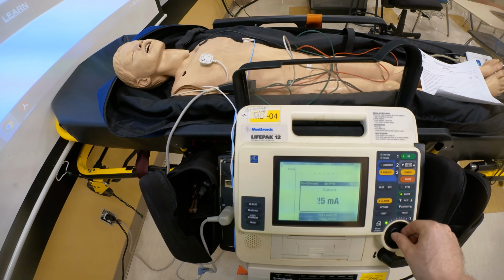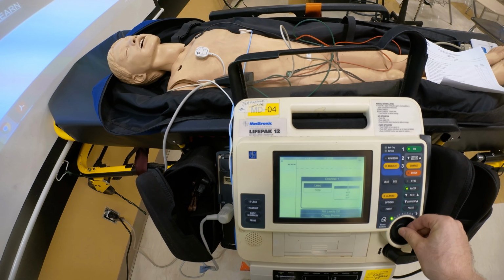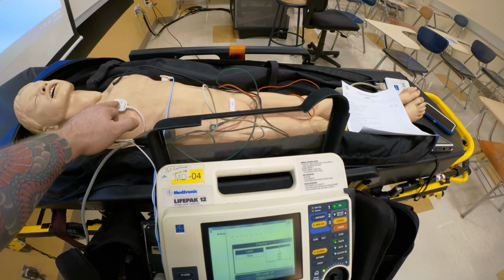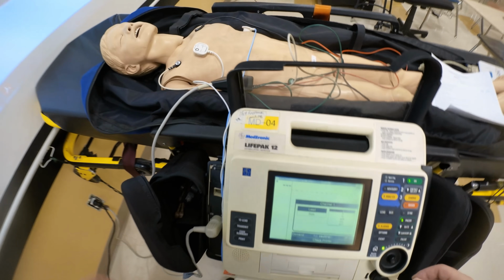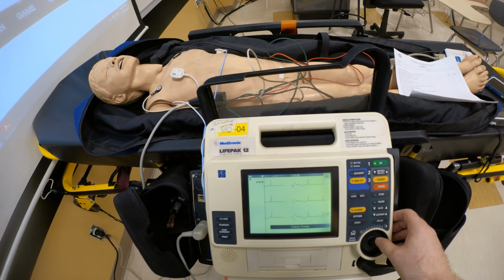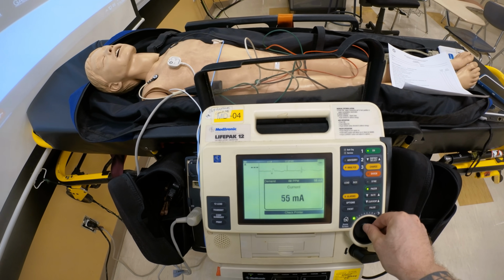And I start selecting my current, I have nothing, right? I have nothing. Even if I go to, right? I cannot select anything because this machine cannot both sense and provide electrical therapy through this alone. So all of this must be connected, right? So once everything is connected, then my pacer is definitely 60, right? Definitely is going to work, right? So you'll see it's functional.